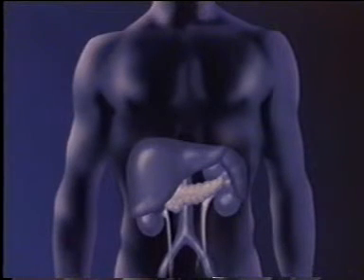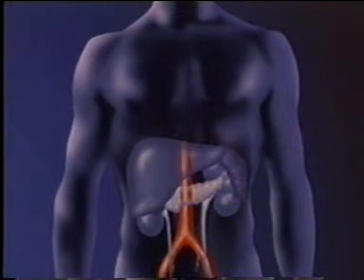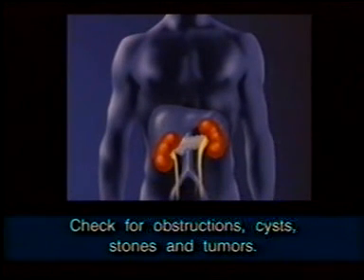To recap, the basic abdominal examination consists of basic renal, hepatic, splenic, and abdominal aortic examinations and a search for free fluid. The renal exam investigates the kidneys to make sure they are free of obstructions, cysts, stones, and tumors.